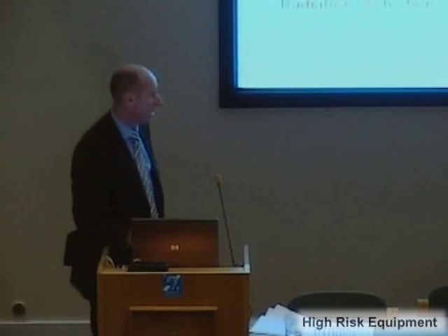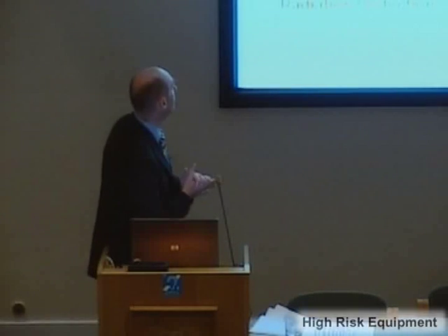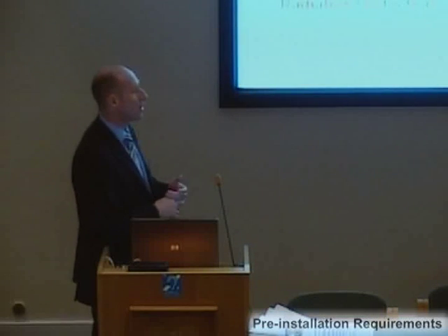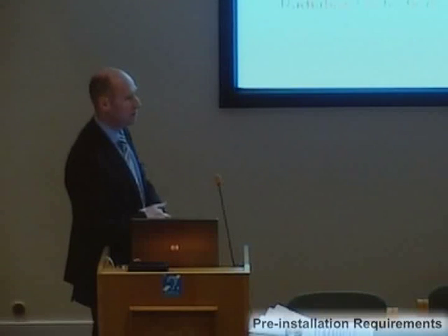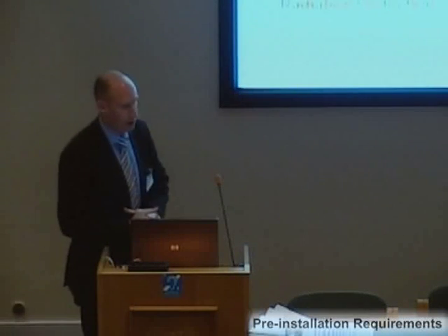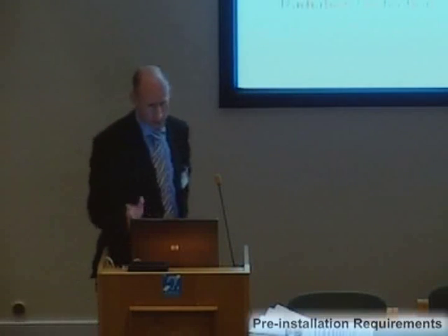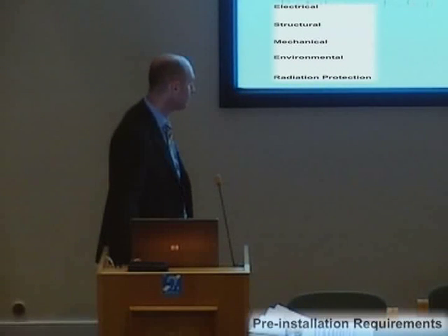So that's really about it on the high-risk equipment and planning. I just want to move on to pre-installation requirements. I can't cover all of them in this timescale, but these are certainly the key ones that I would always sit down and discuss with the design team, certainly on the M&E side. So we've got electrical, structural, mechanical, environment, and the radiation protection.